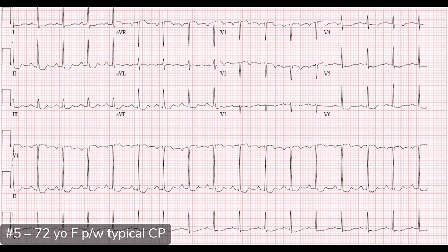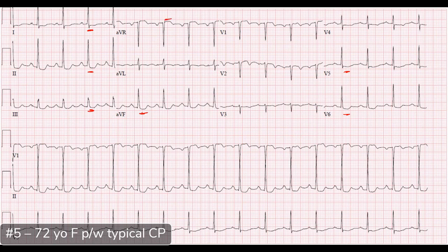On the ECG: heart rate around 100, rhythm looks sinus with a P for every QRS. Axis is normal, intervals all look normal — the PR is borderline around 200 but I'd call it normal. In terms of ischemia, I see multi-lead ST depressions especially in inferior leads 2, 3, AVF and lateral leads V5, V6, and also lead 1. Whenever I see that pattern, I look at AVR — and there is AVR elevation of at least 1 millimeter.